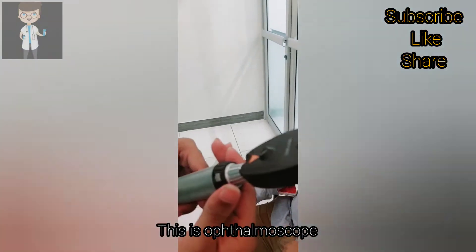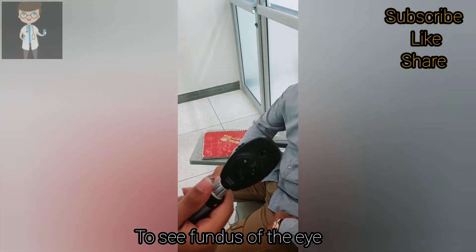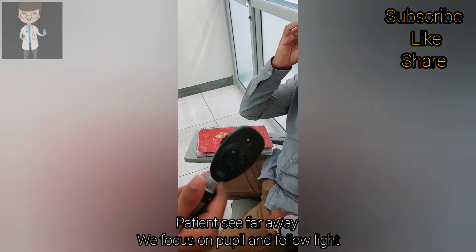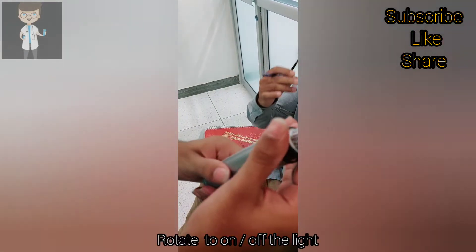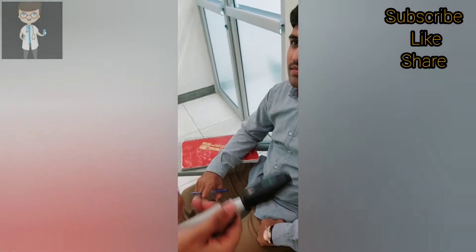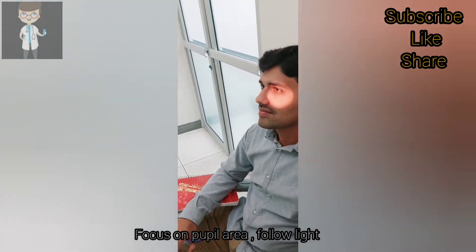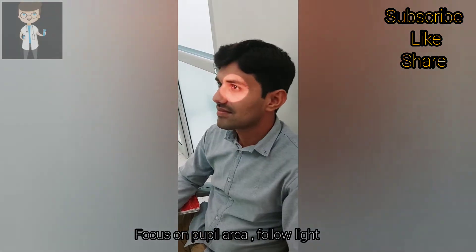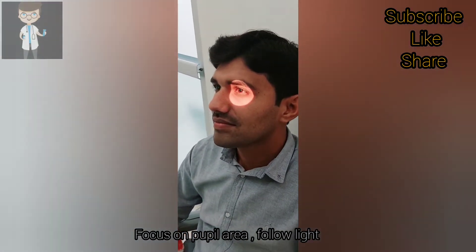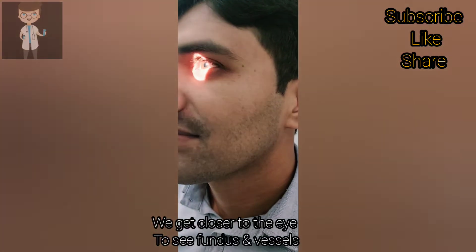This is an ophthalmoscope. From this we focus on the fundus of the eye, we focus on the pupil, and we follow the light. We recommend the patient to see as far as possible. This is a point to turn on/off the light and to set the intensity of the light. First of all, to see far, you have to focus from far away on the pupil area, and we follow the light to get a clear view of the fundus and the vessels.